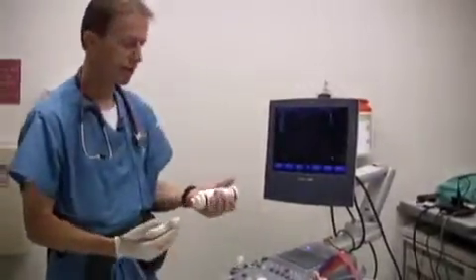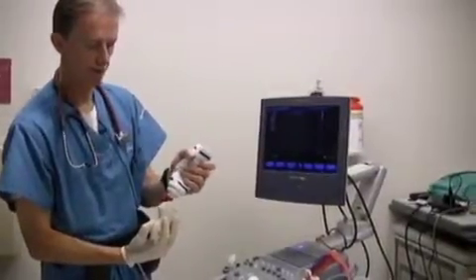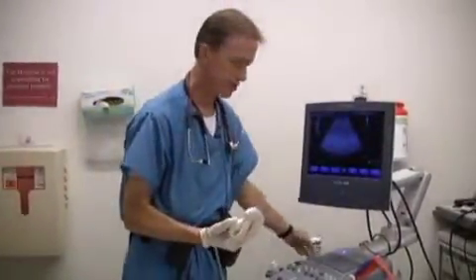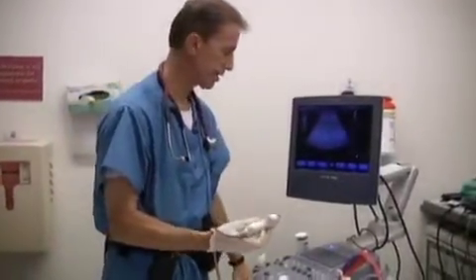We'll demonstrate the first exam. I'll do the exam twice on the ultrasound machine: once as I talk us through it with the findings, and secondly I'll do it in real time to show how the exam can be performed in probably less than a minute. I'll go a little slower the first time through so that it's possible to see how it's done.